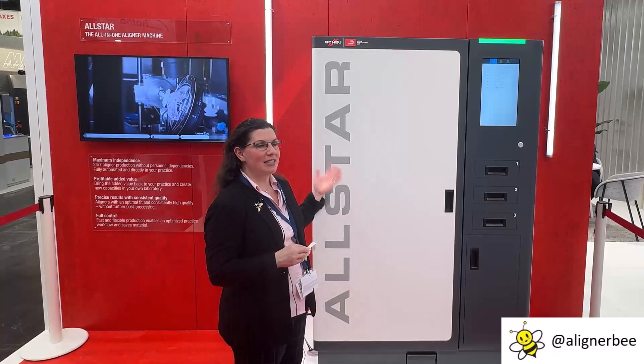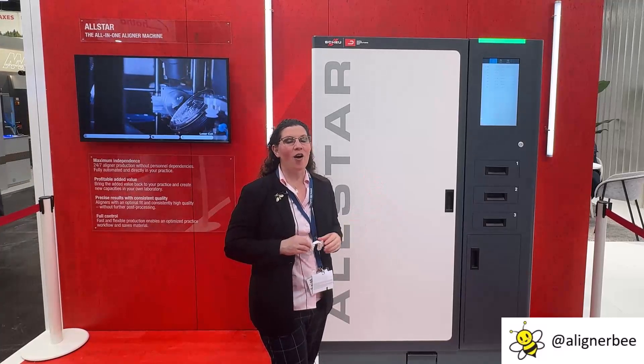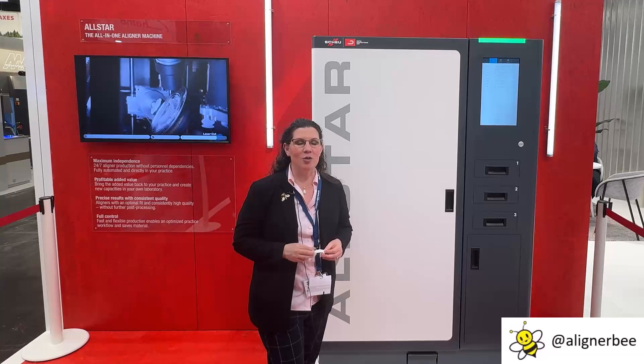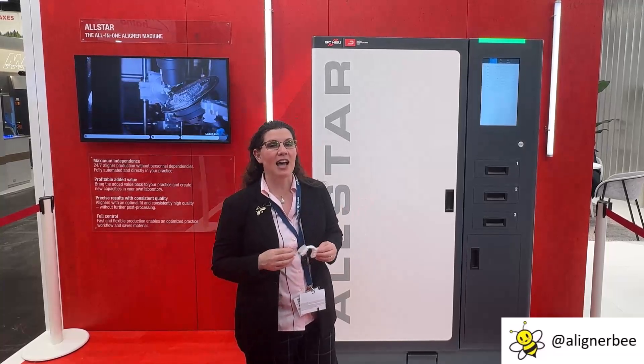I'm standing in front of the Scheu Allstar. This is a completely self-contained and automated clear aligner 3D printing system. I talked with my friends here at Scheu to find out a little bit about the magic and the equipment they've designed and created.